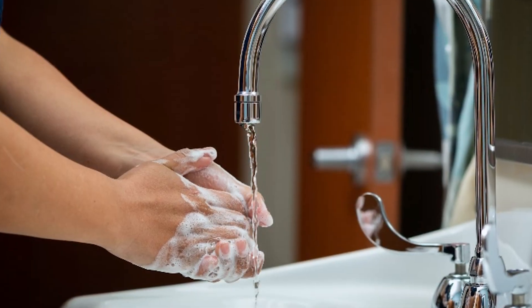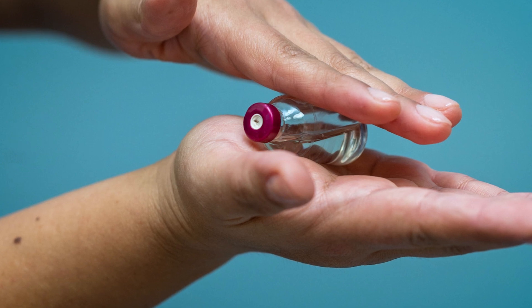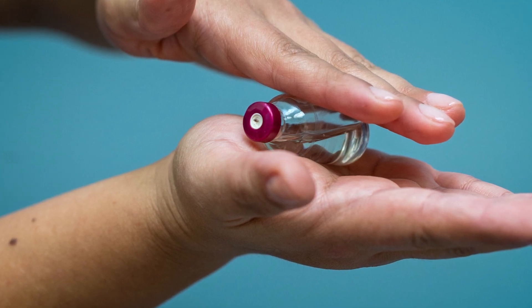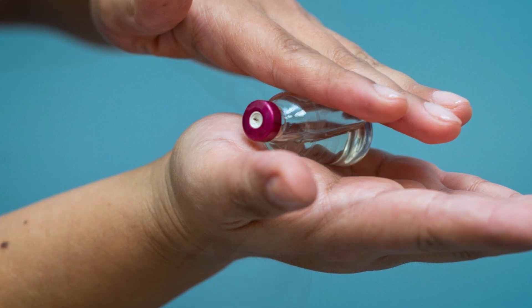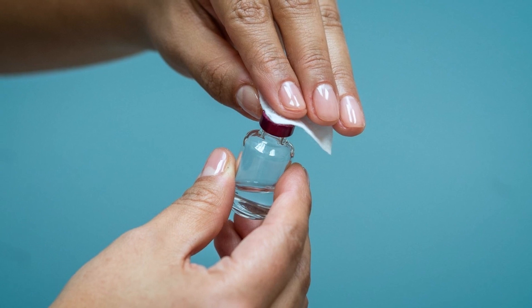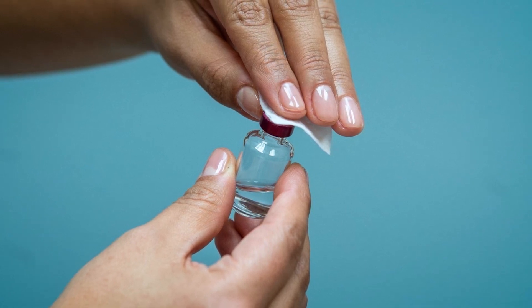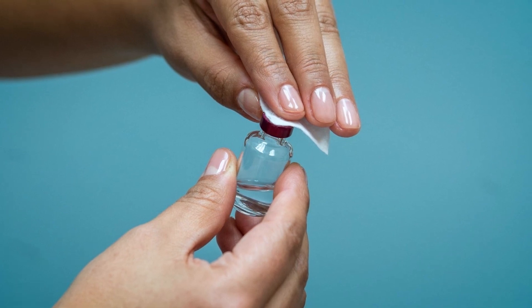Step 1: Wash your hands with soap and water. Step 2: If you are taking cloudy insulin, gently roll the vial in between your hands until it is evenly mixed. Next, remove the cap and wipe the top of the vial with an alcohol pad. Make sure to write down the date on the bottle of when you first opened it, because it is only good for 28 days.